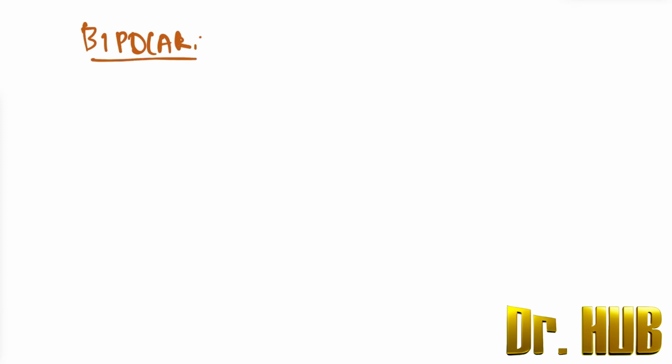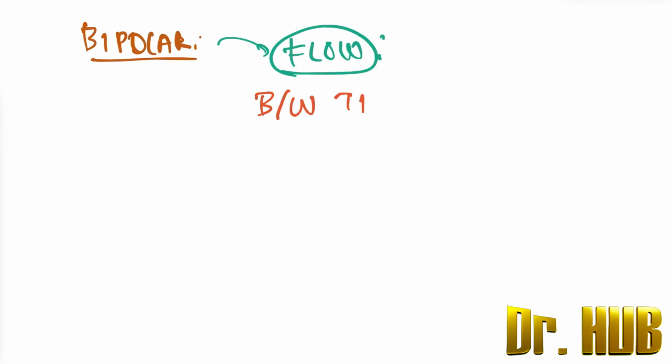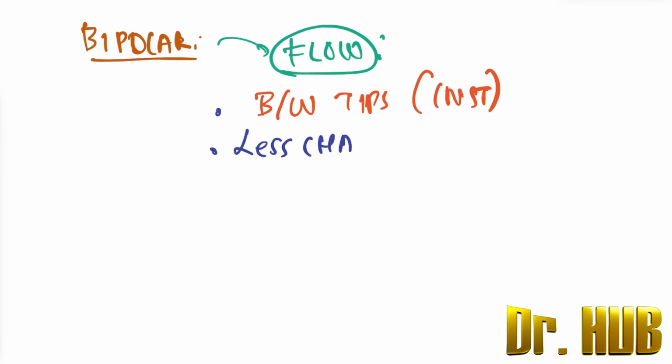Now we'll move on to the bipolar cautery. In terms of bipolar cautery, this is again the flow of current, and it is only between the tips of the instrument. So there is less chance of burns.